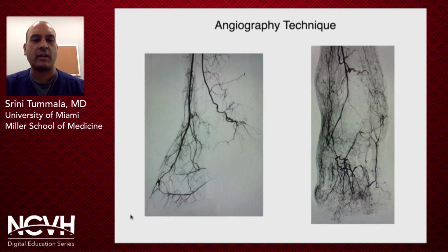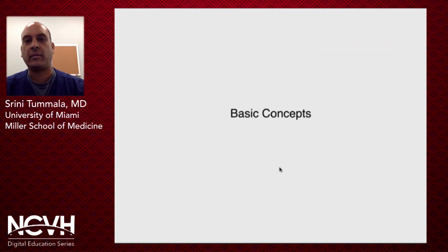And if you do proper angiography, hopefully you'll achieve angiograms like this. This is a case of mine. You can see I did an AP and lateral foot, and it really shows you what's going on. Here's your lateral plantar artery that just dies out. So this gives me an idea that I'm going to have to tackle this posterior tibial, common plantar, and then try to complete the loop in the lateral plantar artery.